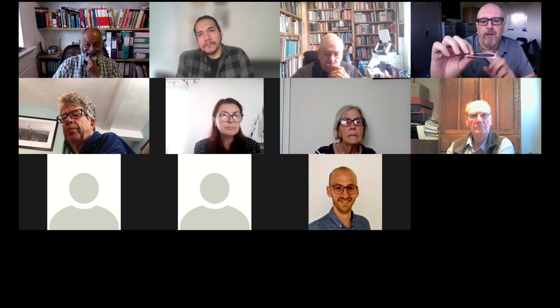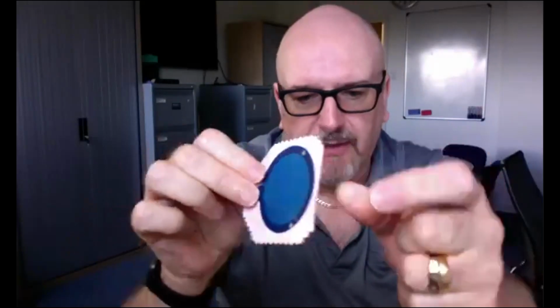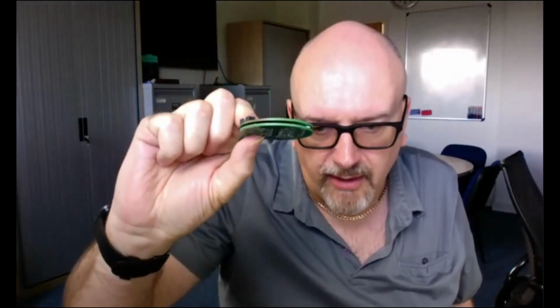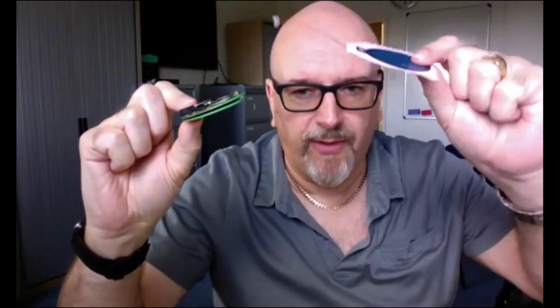So this device here is what I'm going to talk about. It's a sensor that's actually fabricated onto a textile. So you can see it's got some flexibility. There we go. I can see myself there. So it's not particularly thick. It's something that could quite easily be mounted on the chest. The current version of it looks a little bit different, a bit like an Oreo biscuit. It's a little bit thicker, but this has got all the electronics on it. And what we're trying to do is to make the whole thing smaller and flexible, so it doesn't look too dissimilar from that as a kind of final device. So we're not there yet, but hopefully the project will get us a long way in that direction, so that we have something that's a device that's been registered with MHRA, so we can use it in hospital settings and so on. So that's the kind of aim of the project.